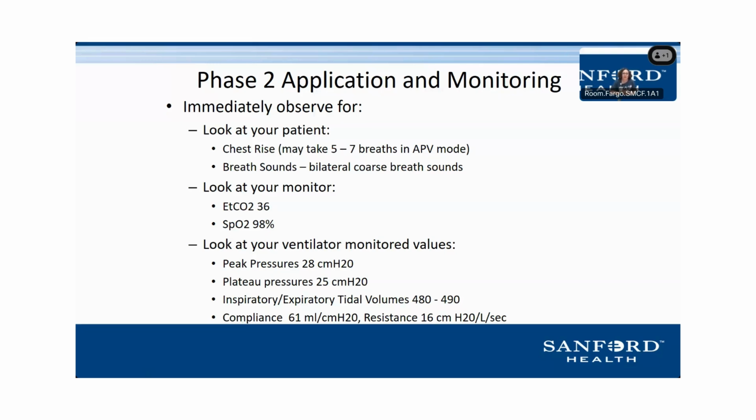One of the things that could help with this scenario is to suction. Obviously, we have bilateral coarse breath sounds, and maybe if I suction, I might get some improvement in my numbers there. But otherwise, if I saw this on my ventilator, if this is how my patient looked on the machine, I would be happy with that. I wouldn't make any changes at this point other than suctioning. In this particular patient, we were suctioning blood when we cleared those secretions.